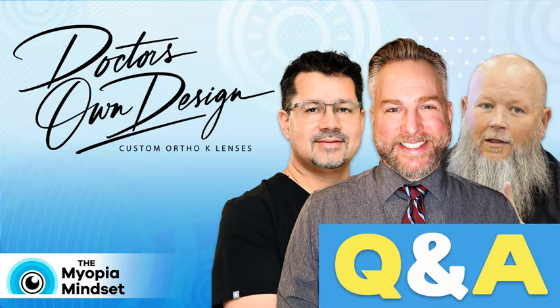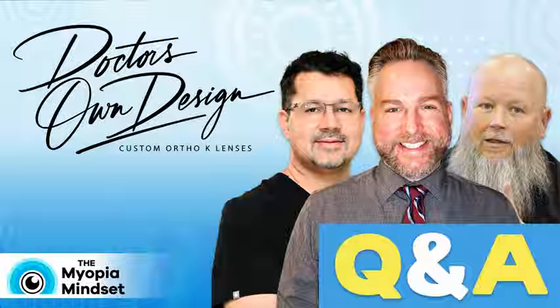One of the things Mark just mentioned was the CCC. That's actually a new term we came up with, called the central corneal clearance. Now, obviously, that's not something nobody else has ever done before, but it helps us describe something that we're changing. We can change the center of the lens. If it's touching the cornea, we can raise it up off the cornea by one step. One step is a measurable change.